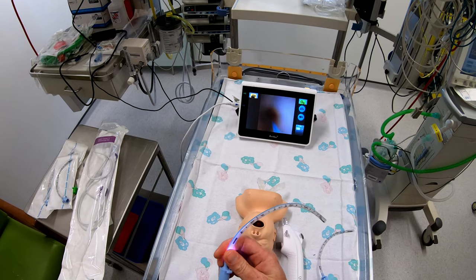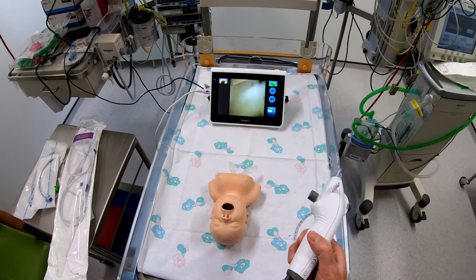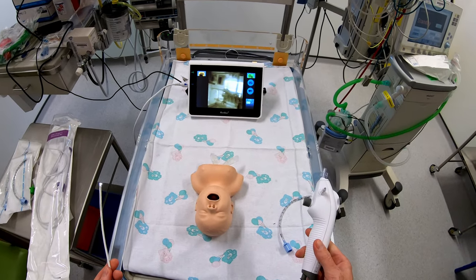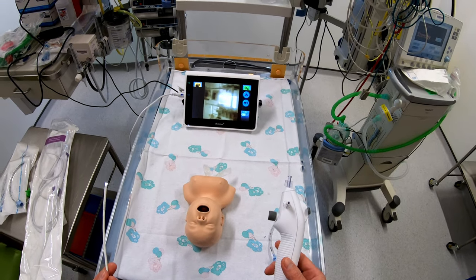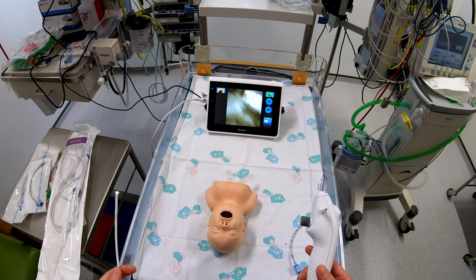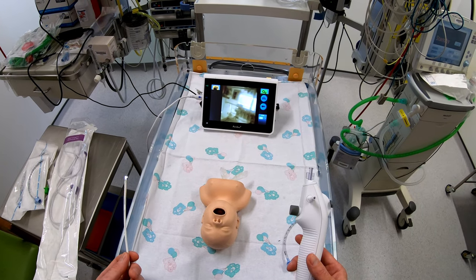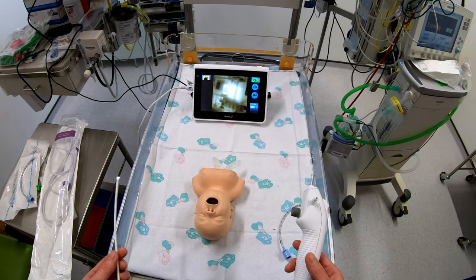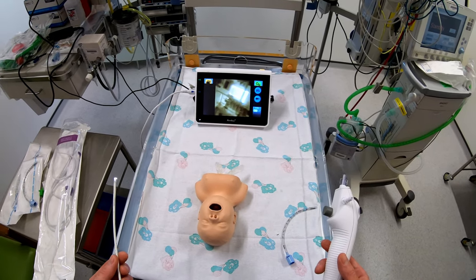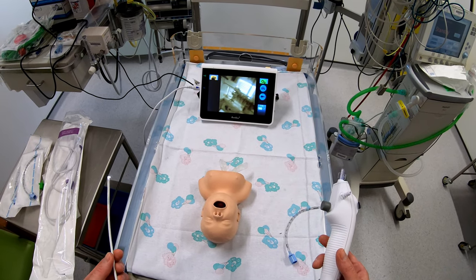This is a four and a half tube and this is actually the smallest tube that the scope will fit down. I did make a previous video showing how you can intubate using the scope, pass a wire down the working channel, remove the scope, pass an airway exchange catheter over the wire, and then pass a tube over the catheter — allowing you to use a size 3 tube to intubate a neonatal model.